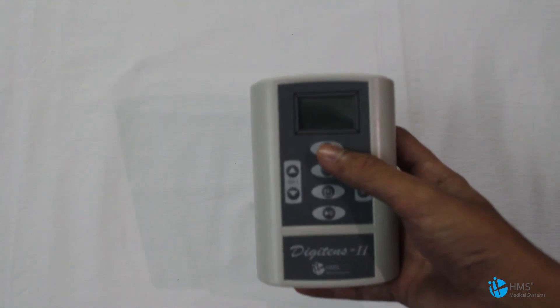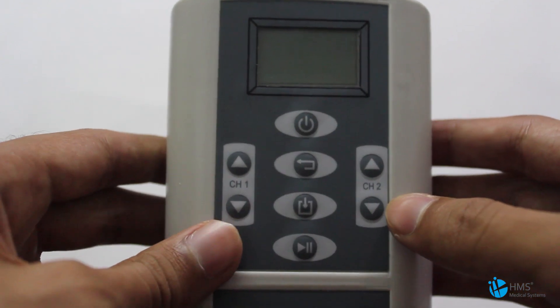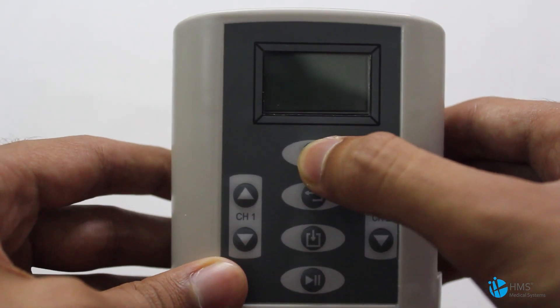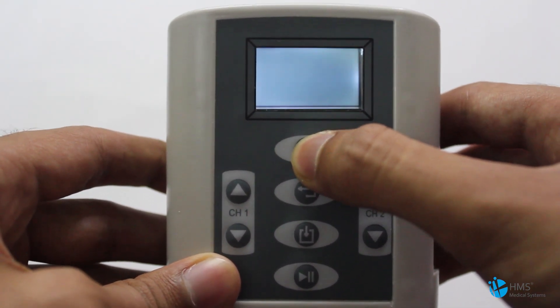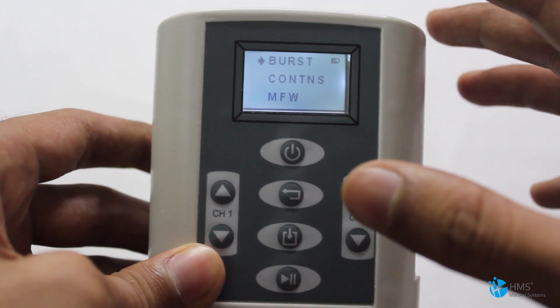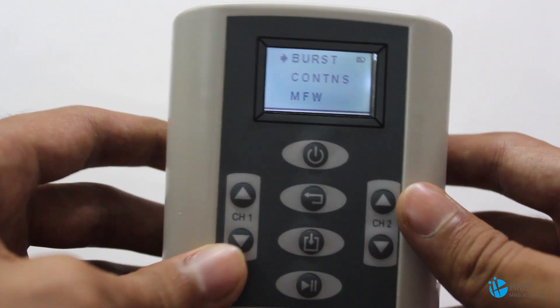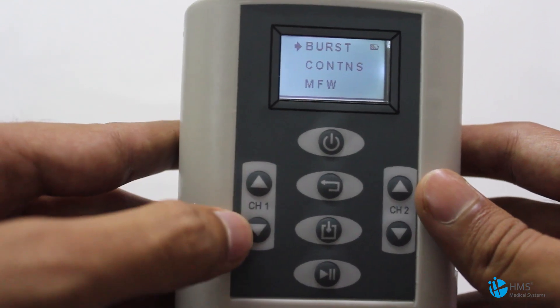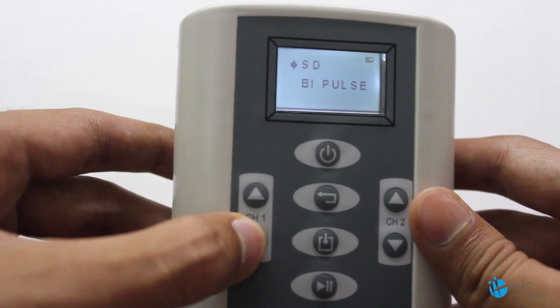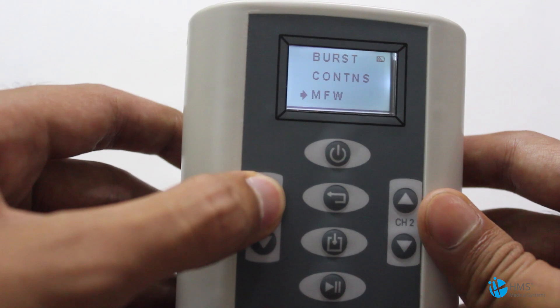This machine is the latest from HMS and there's nothing like it in its competition — it's very advanced. After inserting the battery, it's very simple to switch on. This is the power button; you just press it to switch on the machine. This machine gives five modes, and you can navigate through those modes with the channel and intensity control buttons.